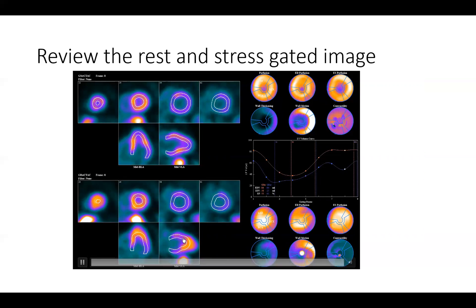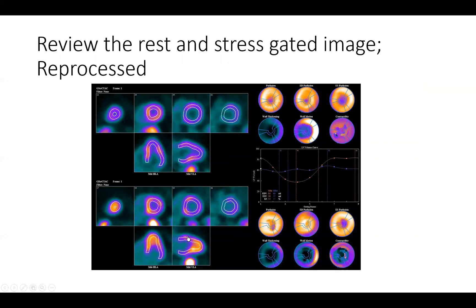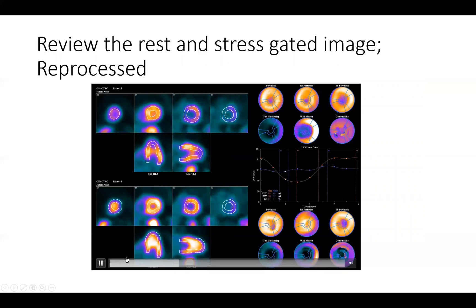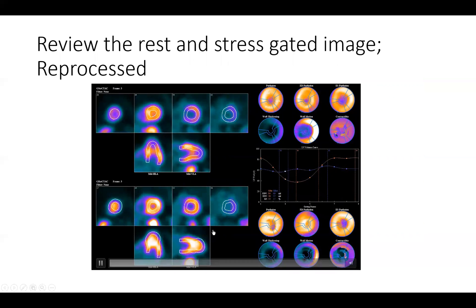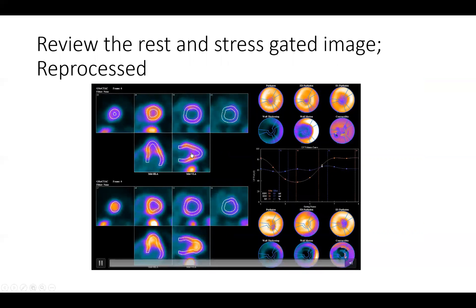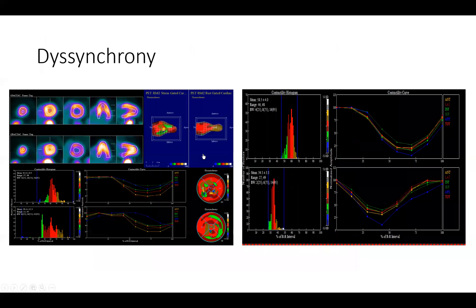Whenever you end up with this situation you try as much as you can to correct it, but even with our best efforts here we tried to correct it and you can see it actually made it worse — the tracking is even worse and the ejection fraction is now 17%. Of course we're not going to report this. So we ignore the rest images because of our inability to track the walls and we will only report the stress images, where you can see this left ventricular apical hypokinesia or dyskinesia.